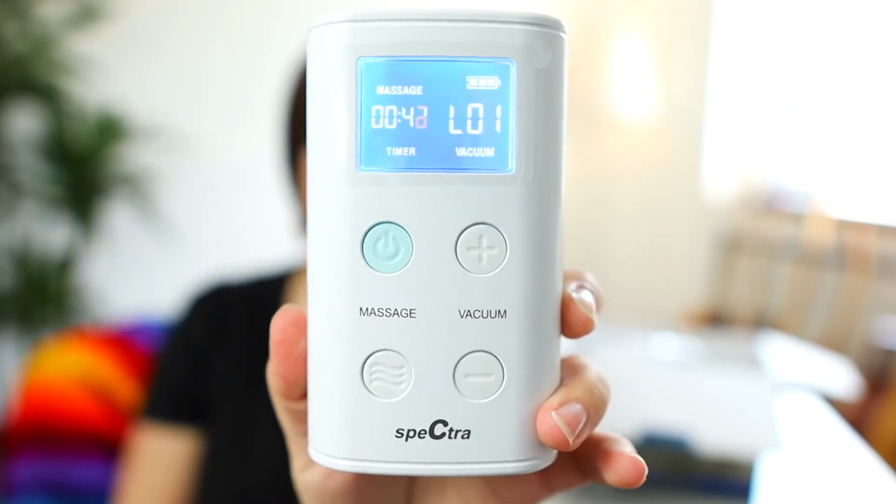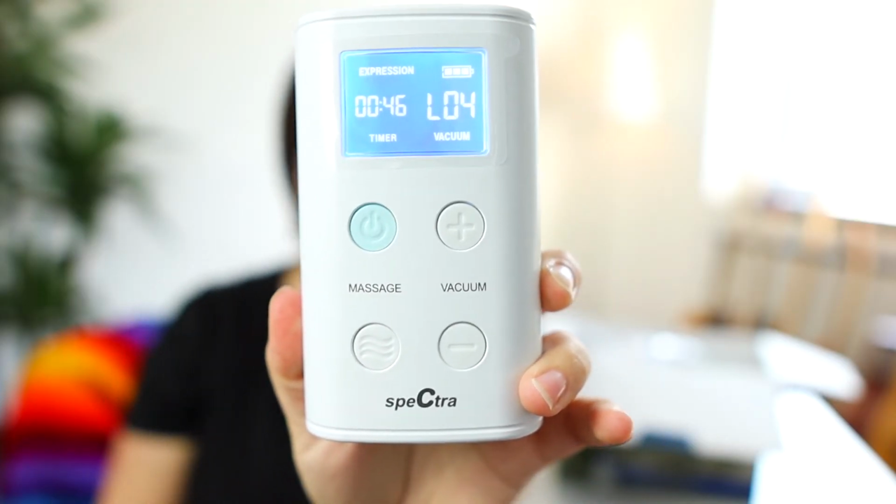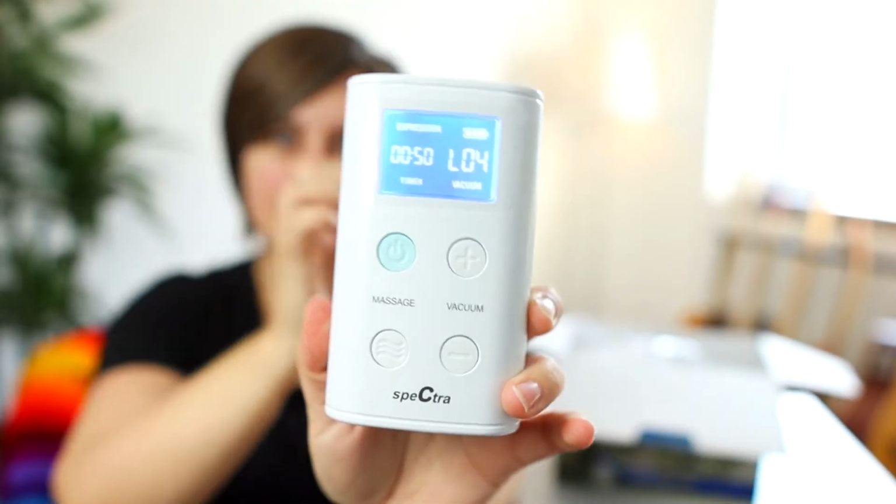It has two modes: expression mode and massage mode. The massage mode is a little bit quicker. It's where you start, and it mimics the baby sucking quicker at the beginning, trying to get the milk to let down. Once it lets down, you can pop it over into expression mode, as this calls it, and go on from there. It's a little bit slower and draws out more milk. So you can start in massage mode, and as soon as you have a letdown, switch over to expression. It's timing the pump up here, and it also shows you the battery life.